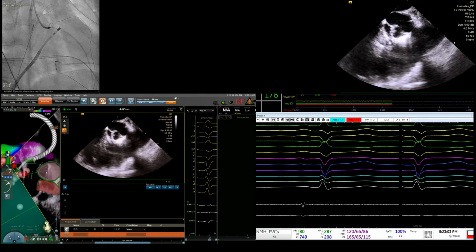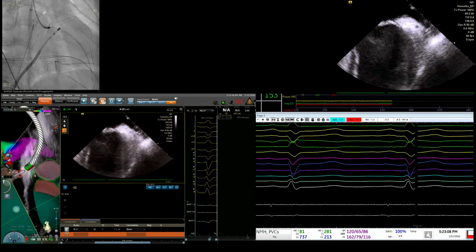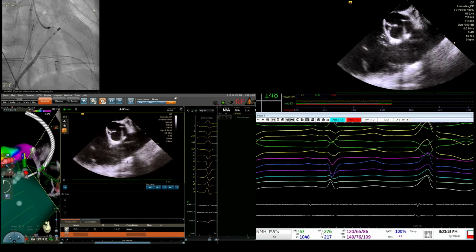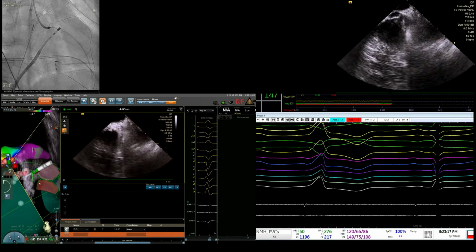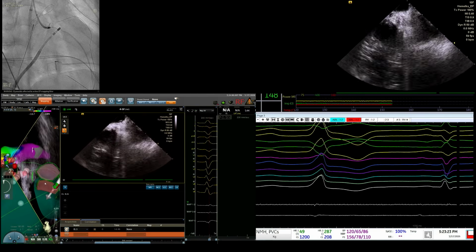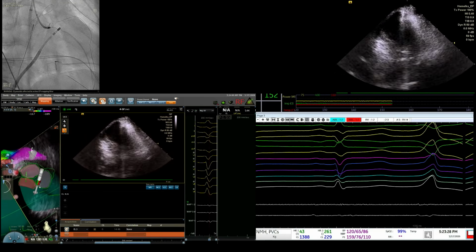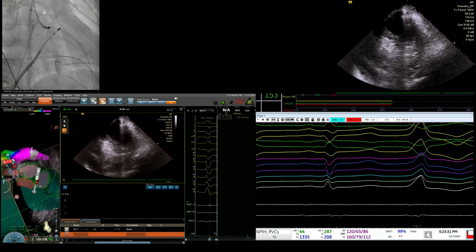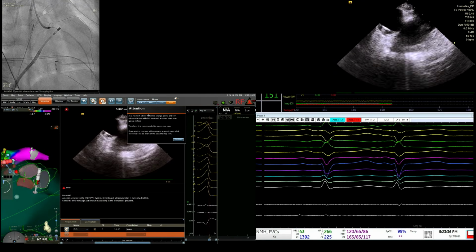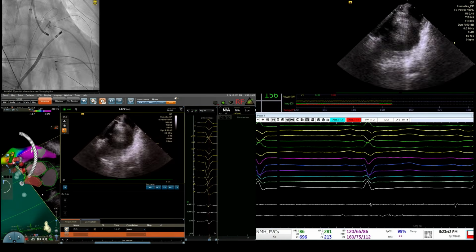I'm not forcing you to do anything. No, but it's a good idea. When you do this, you always have to map all the anatomical neighbors because that's where you're finally going to get it. So this is the EGM in the left coronary cusp. This is just 2 grams of force. The only thing you always have to do is, you see there, that's the left main, so I try to avoid the left main. Yeah, this is the left main right there. That's the left main on the left coronary cusp. So I always try to be below that. So this is the left main, and this is lower there. So we're going to drop the catheter lower to that region and then see how it looks.